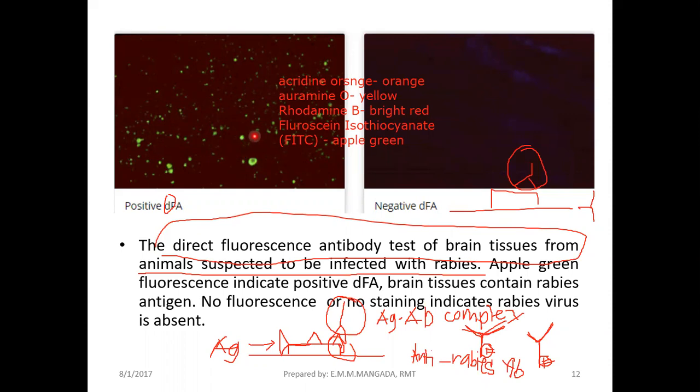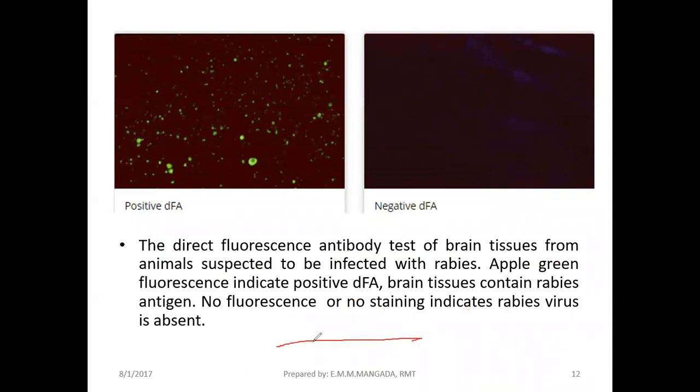So guys, yung ginamit nila na label para dito sa mga antibodies natin ay actually FITC. So, ito sila, kunwari yung mga bilog na yan. Kapag nag-bind si antibody sa antigen, sasama din pati yung label, kasi labeled yung antibody natin. Anong kulay? Apple green. Ulitin natin to. So if for example, this is the tissue, and the tissue actually is containing the antigen, your antibody will bind this. Your labeled antibody. Bakit labeled? Because your antibody is actually labeled with your FITC.